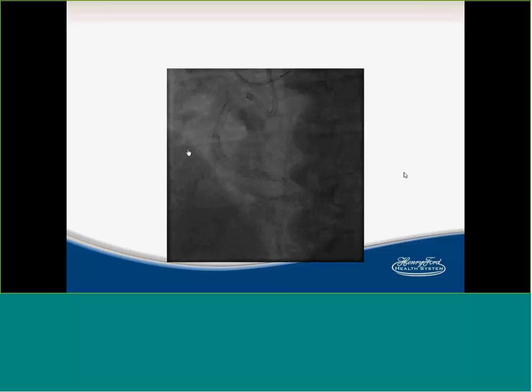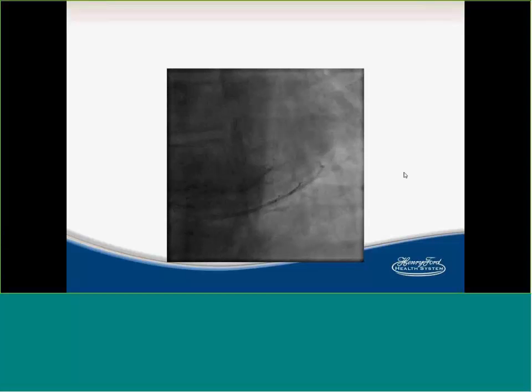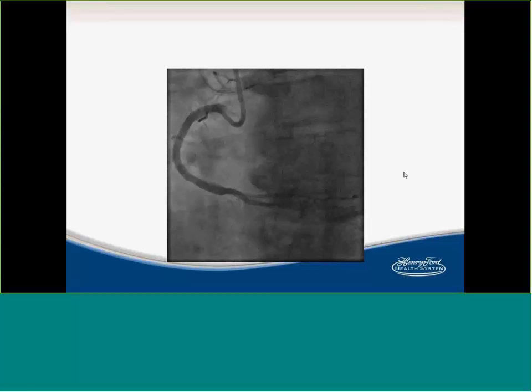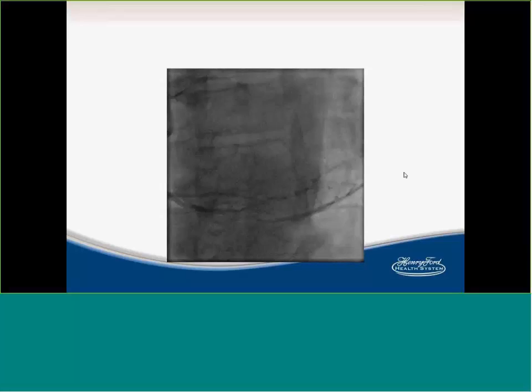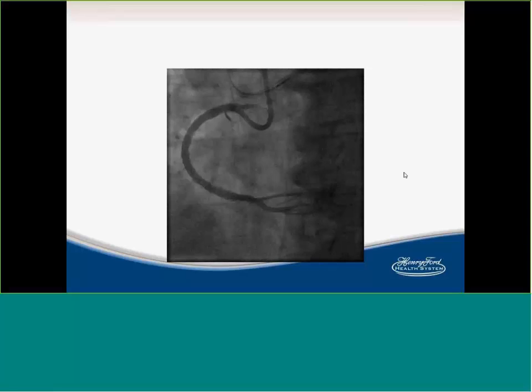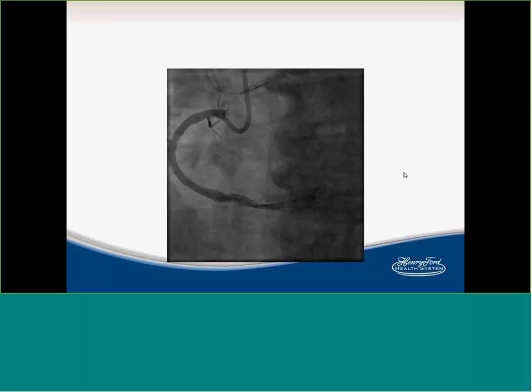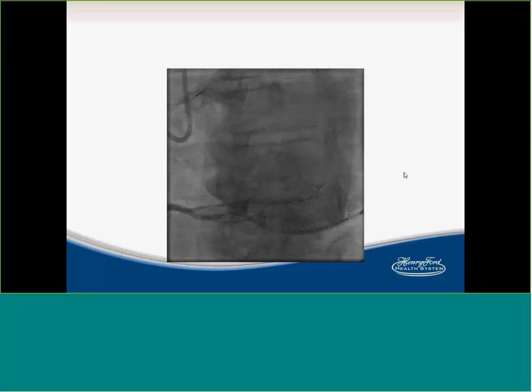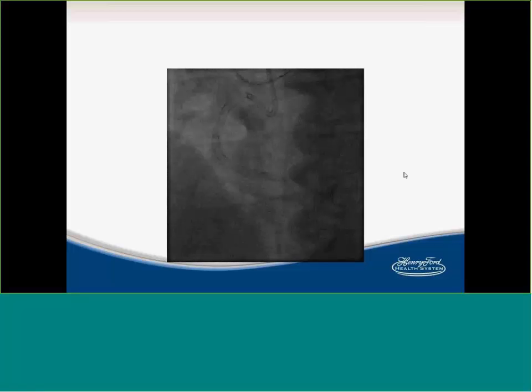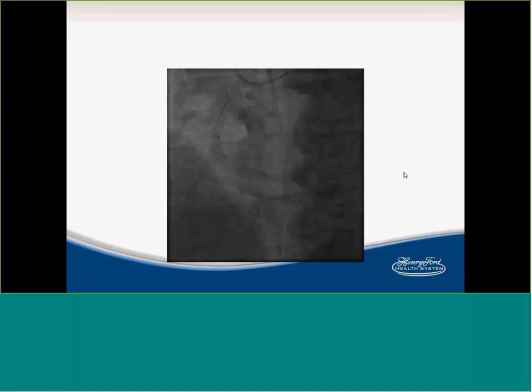And that tells you this patient came with acute coronary syndrome. He probably had a lot of spasm, and sometimes the vessel relaxes later, and you have an undersized stent that will definitely close. So I'm not sure how to solve this issue, other than to remember to give plenty of nitroglycerin before you decide on the stent size you're going to put in the RCA. This patient tells me he walked 2 miles the next day. He got up in the hospital and started walking, and he calculated that he walked 2 miles. He's a software engineer, so he knows, and he had no chest pain the next morning, and he went home.